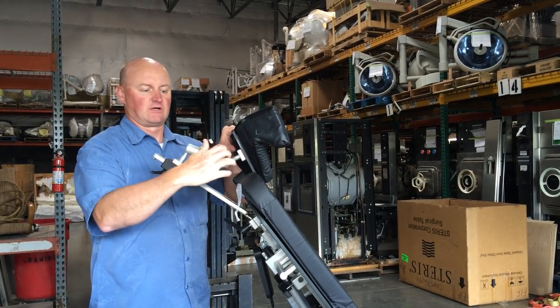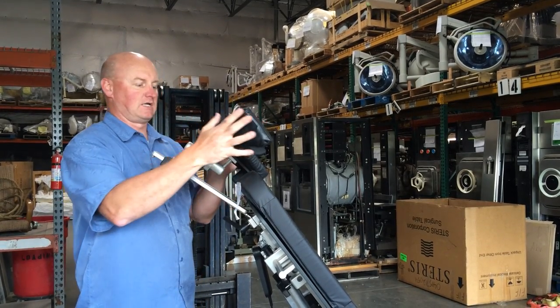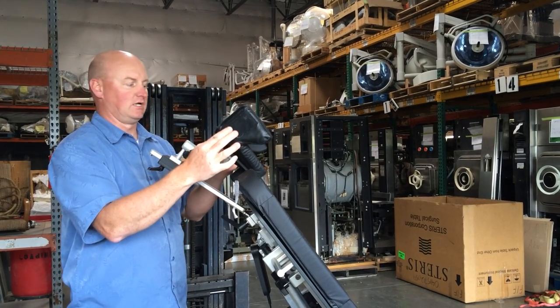It doesn't really matter which direction it's positioned — it's pretty stiff. You just center it and then you can move it around. It's very easy to maneuver. So you lock that down and now you've got head positioning here.